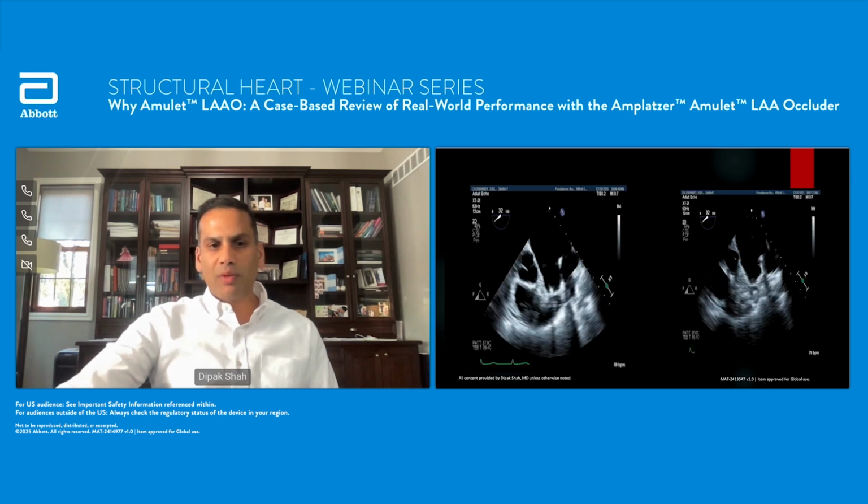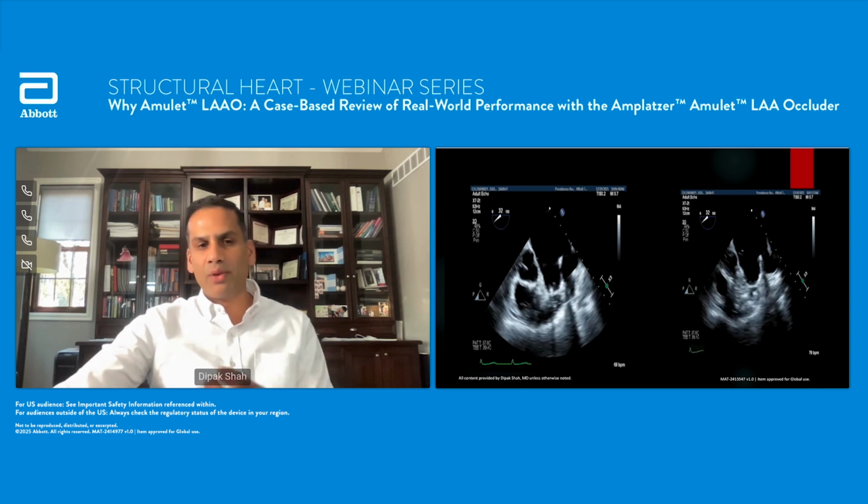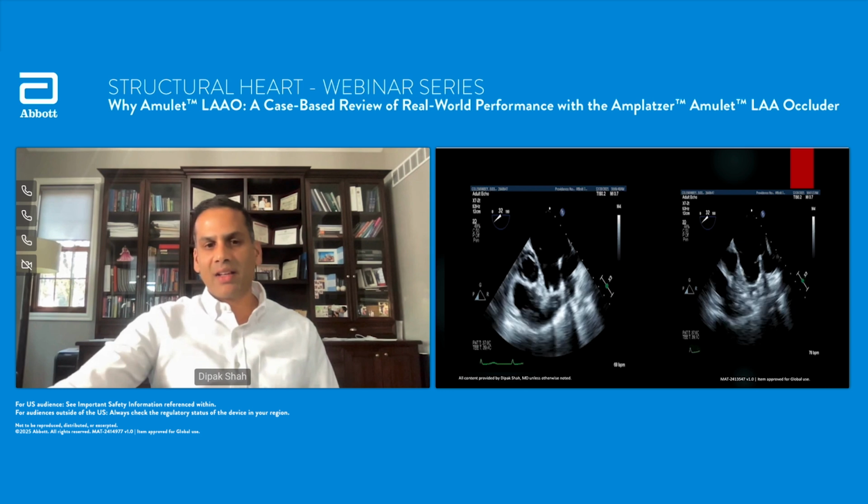So you'll be surprised that it was very easy to get the ball configuration, as Dr. Shah had said, from the proximal part right past the neck. Because when you see that leak in multiple views, there's definitely a larger hole that can be appreciated. And obviously CAT scan can really kind of quantify that for you in good detail. But we got it passed very easily.